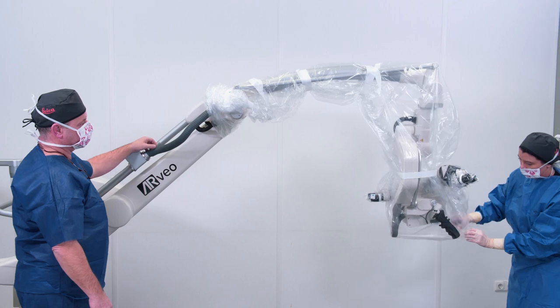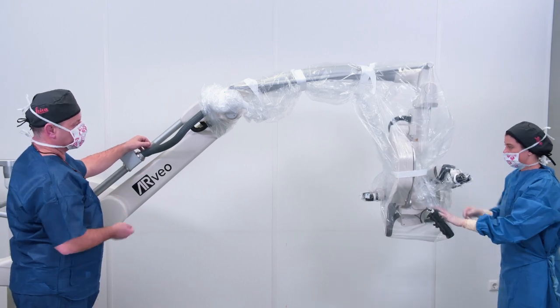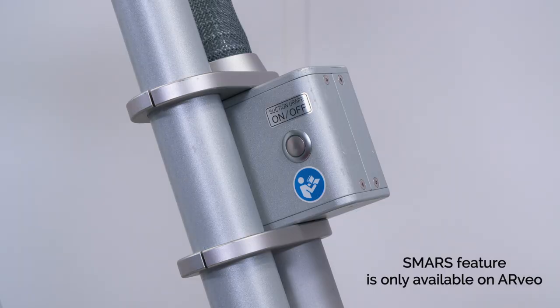If your microscope is equipped with SMARS, the circulating nurse will press the SMARS button. This will activate the pump to extract the air from under the drape.